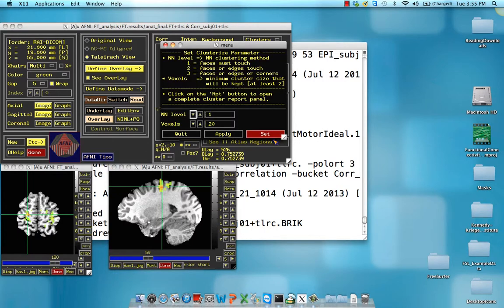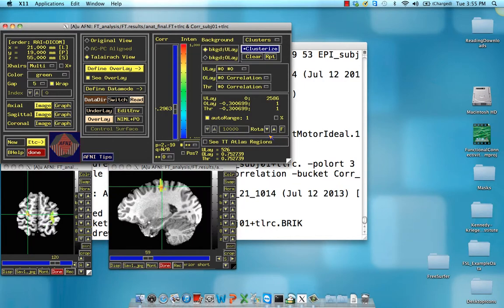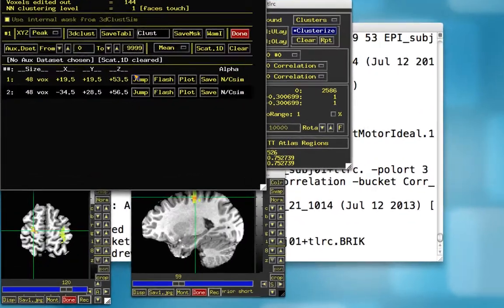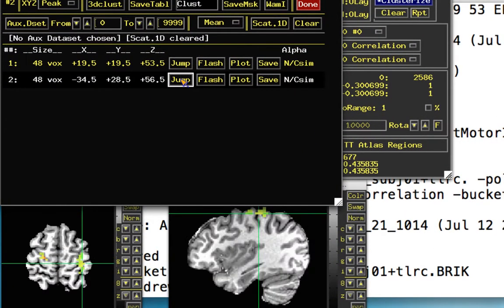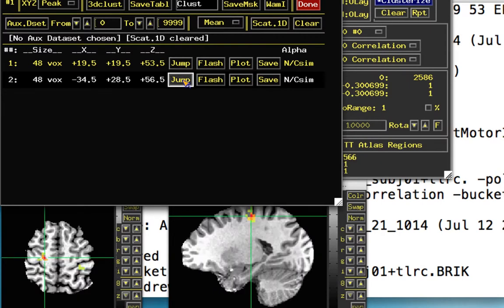Let's click on clusterize to make this a little bit nicer. And click on report. We have two voxels of 48. One on the left, one on the right. Now one's a little bit more post-central, I would say.